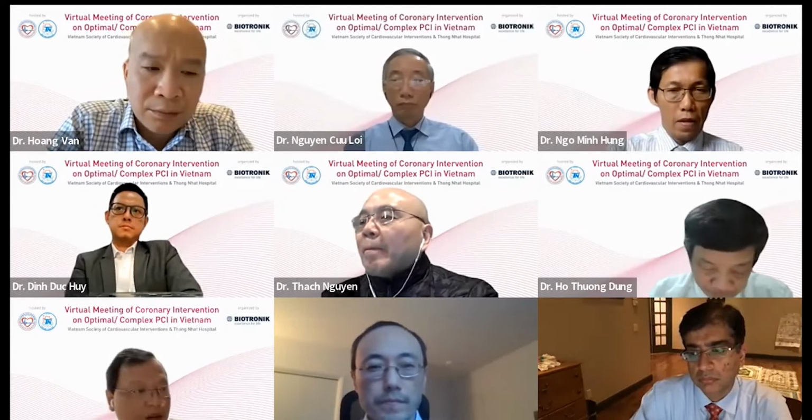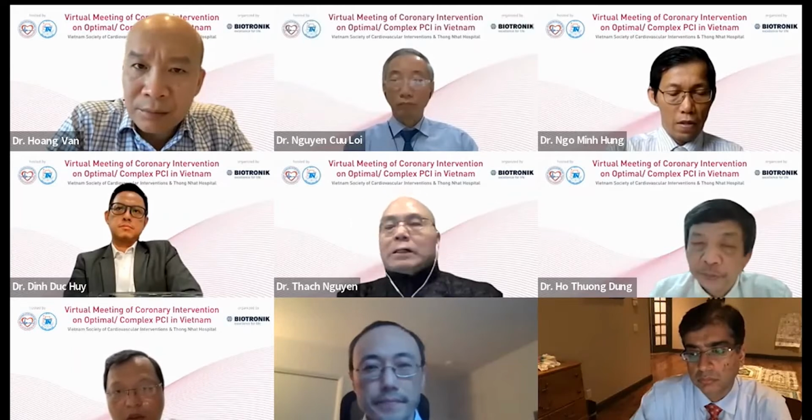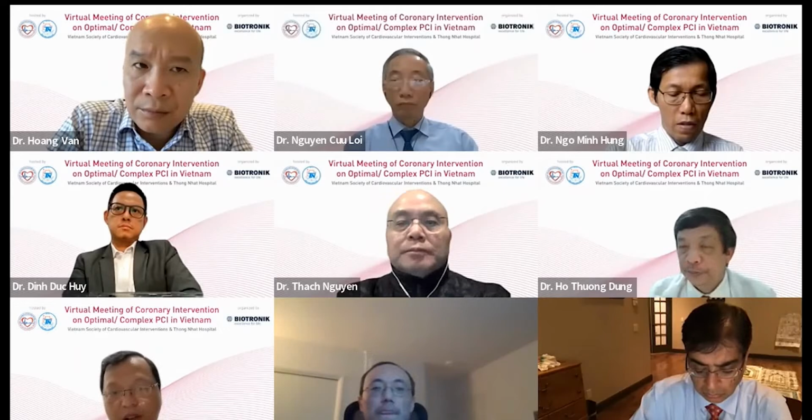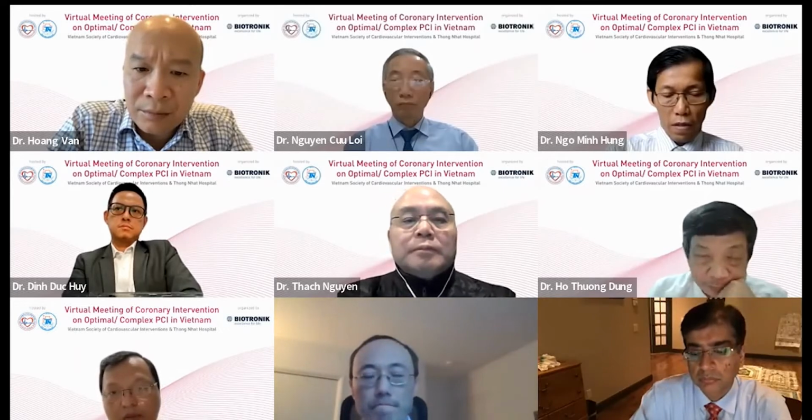Is your question about IVUS? I think the first presentation from Dr. Latif told us about the definition of small vessel depending on IVUS measurement. I think IVUS is very useful, especially for long lesions.